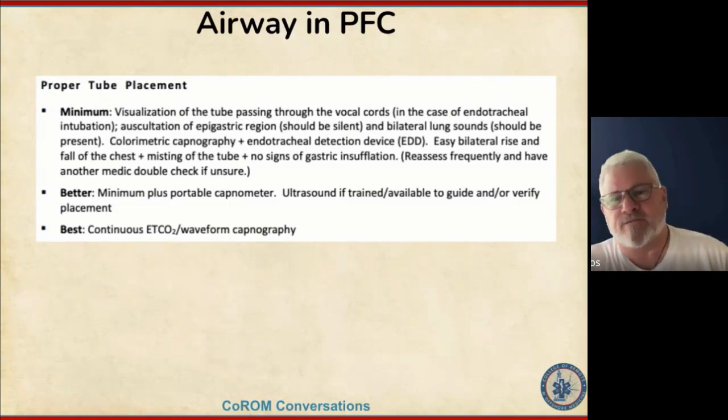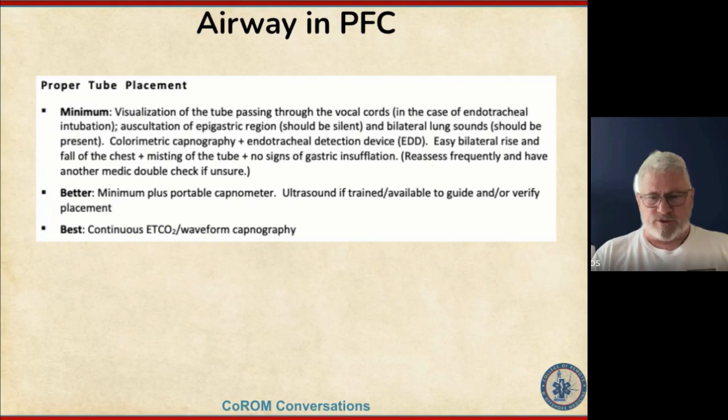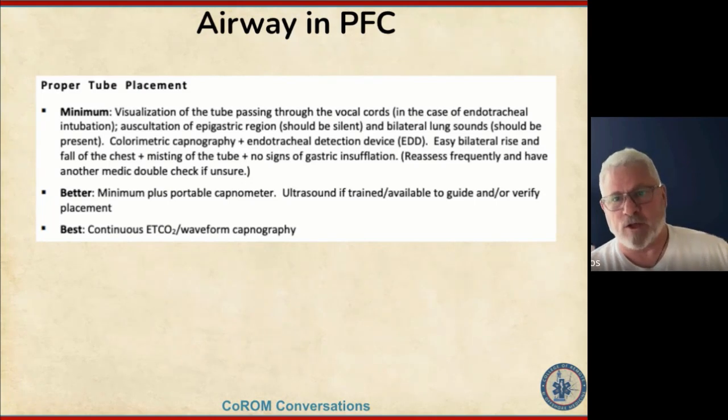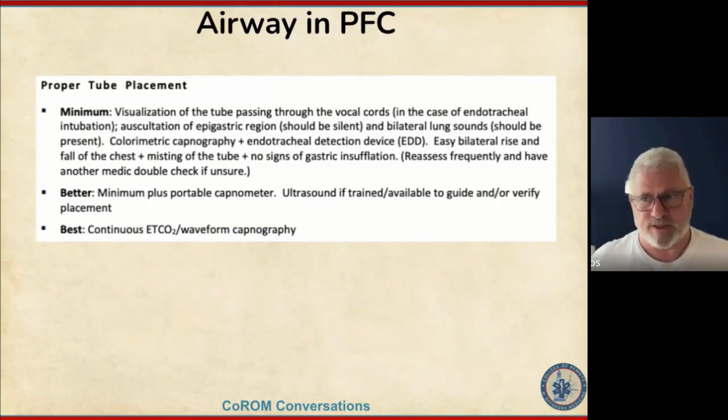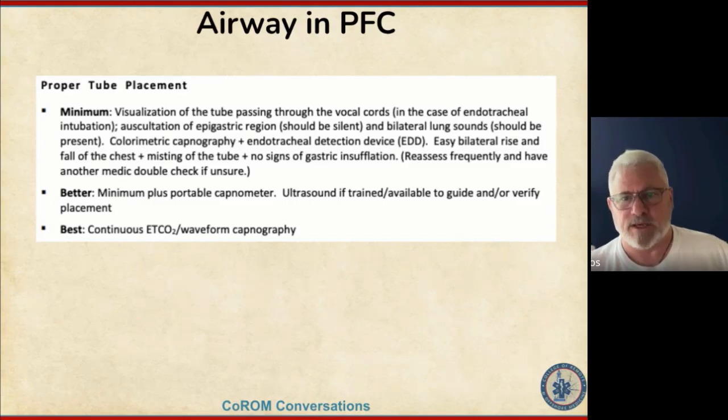And then you can listen in the right. But if you listen in the left and they've right main stemmed it, of course, you have a visual indicator. If they've hubbed the tube and they're in the lungs, they're going to be in the right main stem overwhelmingly, right? So you listen to where there's going to be a complication first, stomach, and then you listen into the left lung. If the tube is too far advanced, you should have diminished breath sounds. And then you listen in the right, which would be the ideal location where you'd hear both.